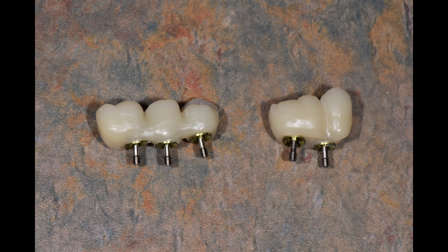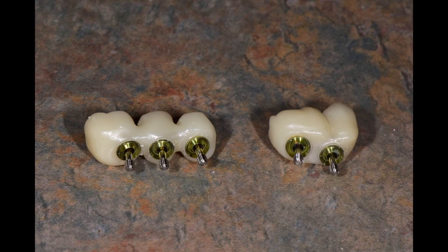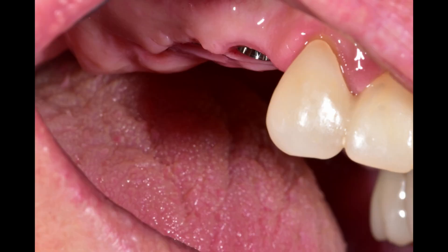These are tie bases that allow for about 25 degrees of angle correction, because the driver is a ball-nose Torx and it can torque 35 newton-centimeters even at 25 degrees.